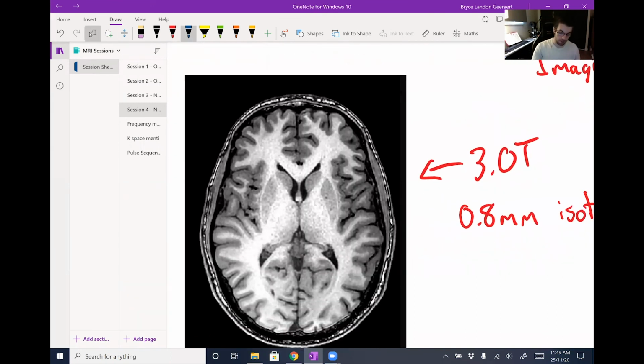This is the effect of noise. If I can just highlight the thalamus area in orange, there should be an area that's darker gray there than the white matter beside it, right? So some of that information is meaningful, but not all of it is. There's some blurry grays and whites, and that is noise that we can't avoid. We just need to collect enough signal to outweigh it. Similarly, up here, this is all white matter, but some of it looks almost as gray as the cortex around it just because of noise, right?